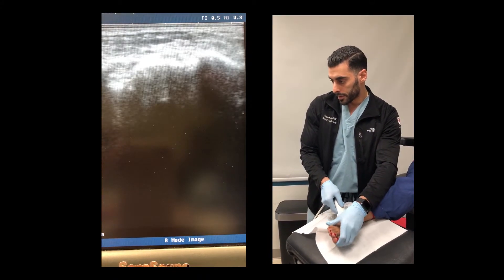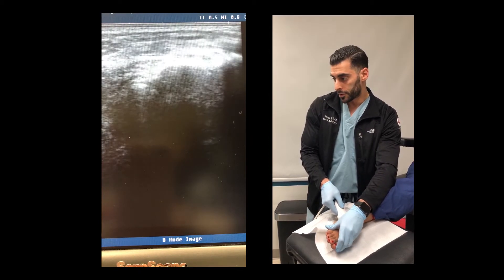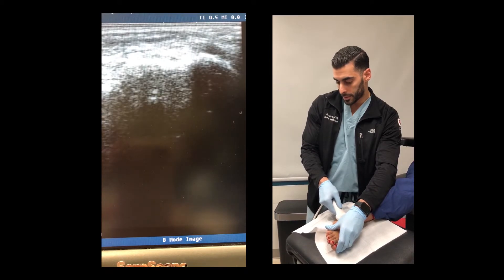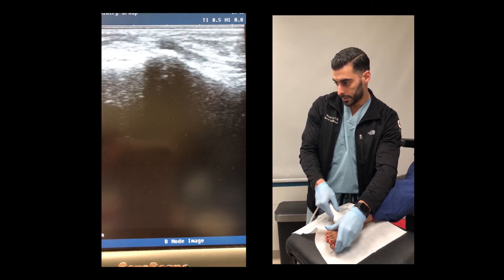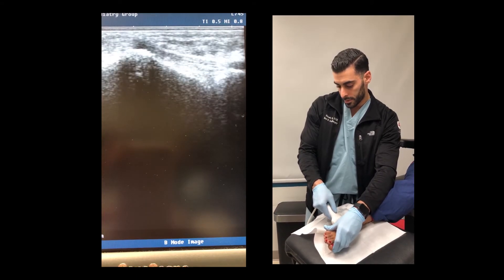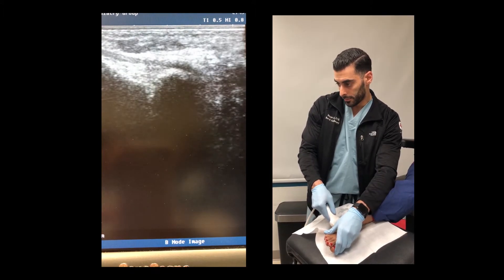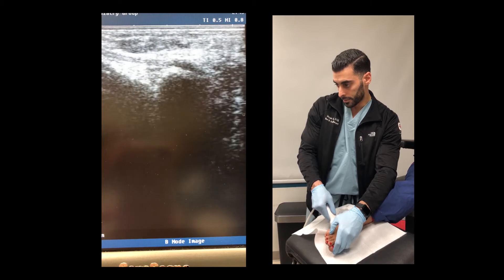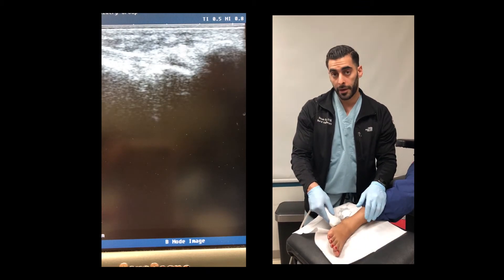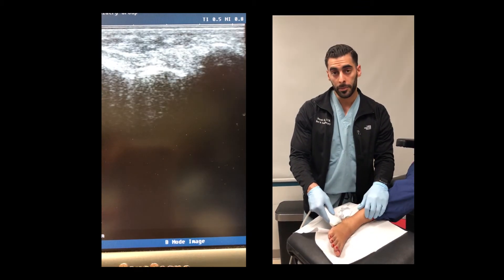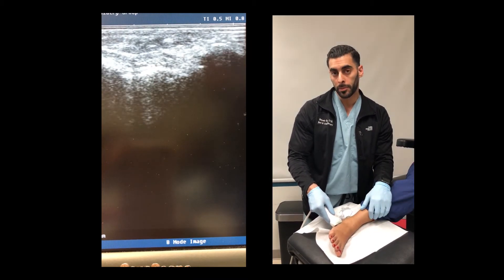Again, using movements of the foot to identify the fibular structure and making sure that there's no pathology along the way. You can see it right there as we're working into the fifth metatarsal base — there's the peroneus brevis. I know it's a little difficult to identify, but here's an example, and I'm going to show you some images that will help you to really master this.